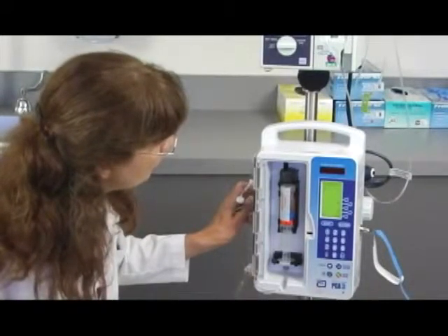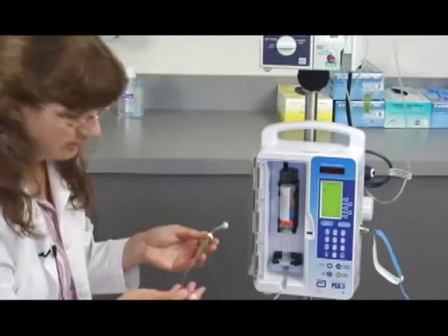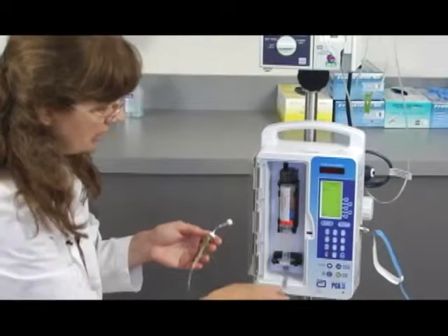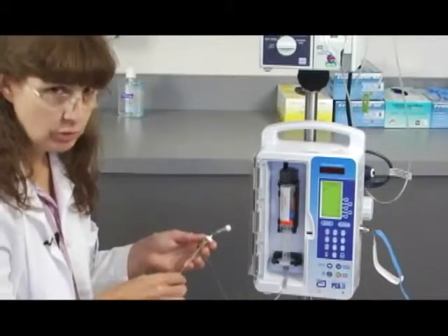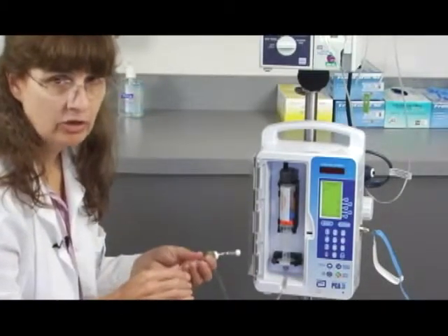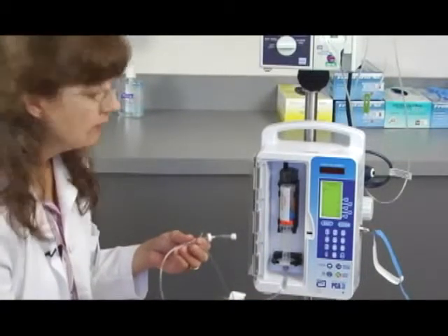Now it's asking if I want to purge. Because I'm not hooked up to the patient, I could go ahead and use this function. Purge means that the machine itself will force medication out through the tubing. As I mentioned earlier, I could have used that function in order to get the air out of this portion of the tubing.